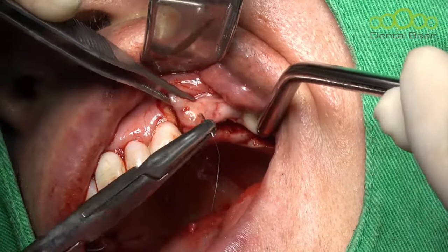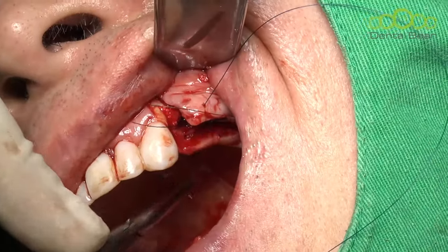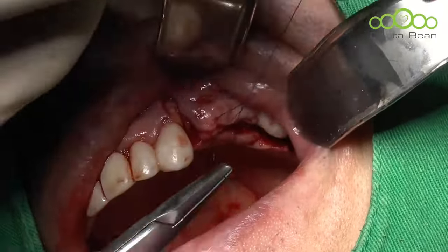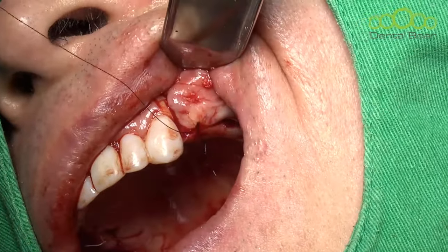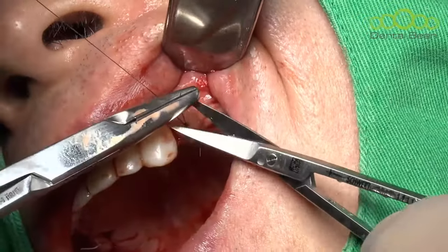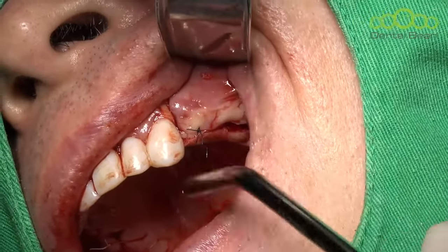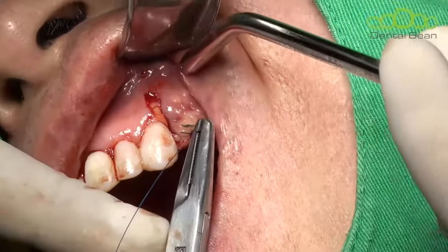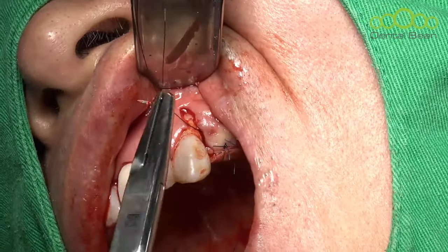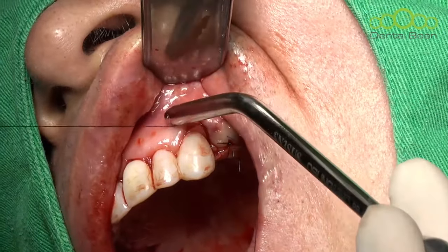From China, one dentist asked whether drawing directly on bone with a pencil is harmful. There's no report about that. Maybe it's carbon, so maybe not so good for health. But I used a very small amount, so maybe no big effect on health. If you worry about that, find a medical pencil, medical marker. And if you have no medical marker, you may remove the pencil line before closing.